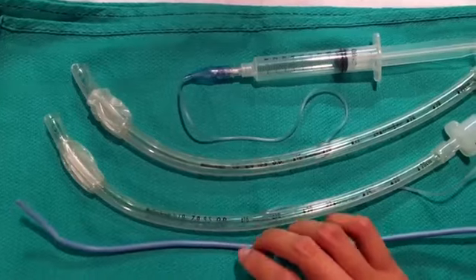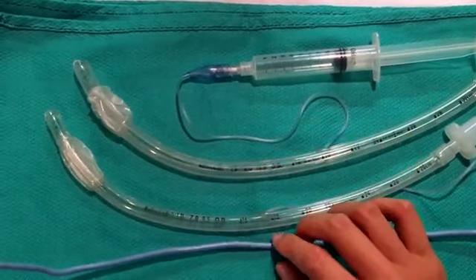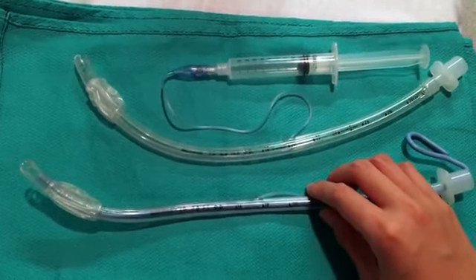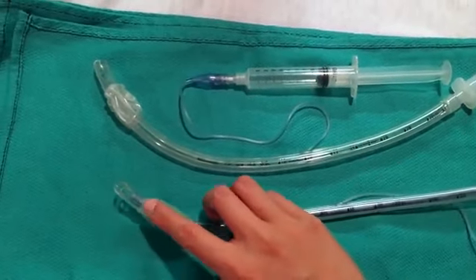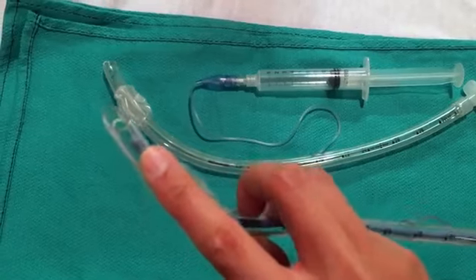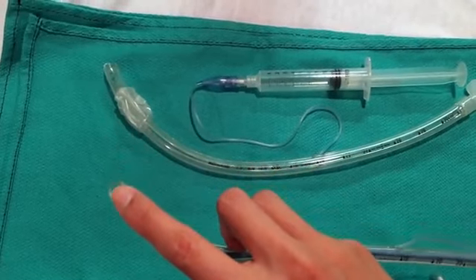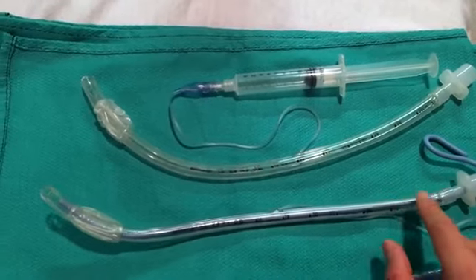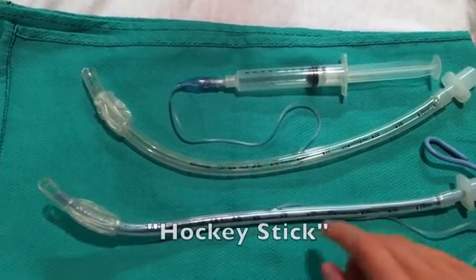But this is an introduction to ET tubes right now. So I just inserted the stylet into the size 7 ET tube. As you can see, it does not extend past the end of the ET tube or the Murphy's eye. I forgot to mention that when placing it, it should look like a hockey stick.